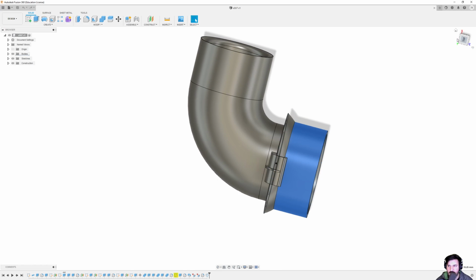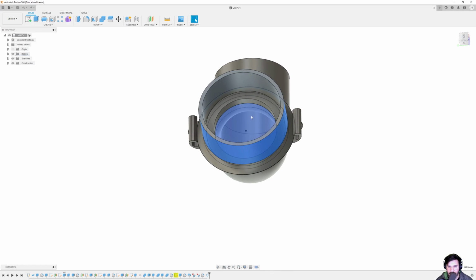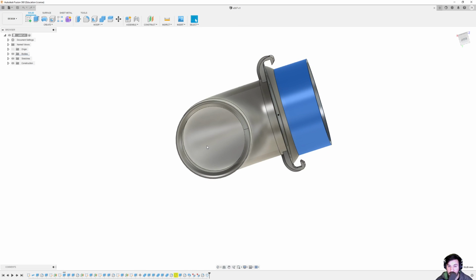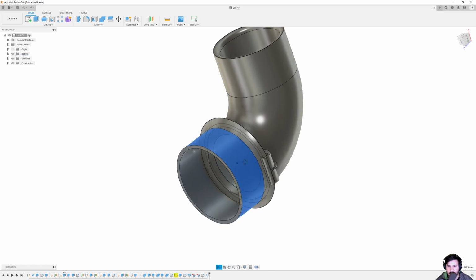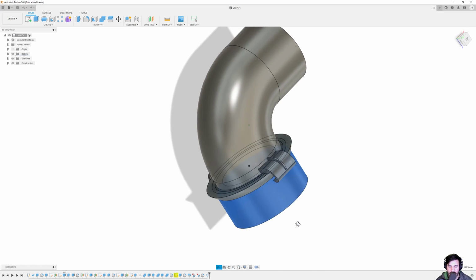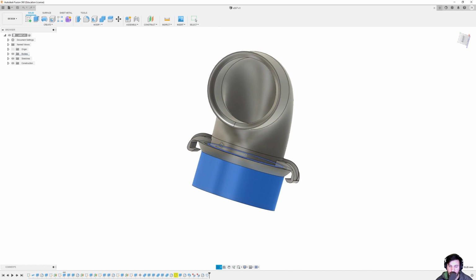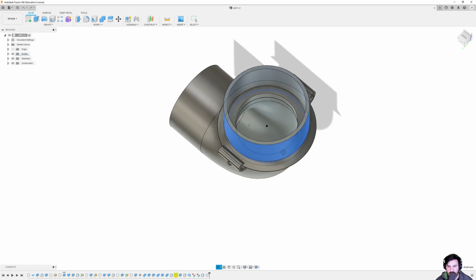So we ended up printing it like this, which required supports underneath here, underneath here, underneath here, and some supports to support this area right here, which would be inside of this cavity. But all the way down this circular chamber was empty, because this curve it could do with some minimal supports underneath. This curve it didn't need any supports for. And of course, this builds straight up, so it didn't need anything. So that was great. And instead of using old saturated PLA, we ended up using ABS, which is less brittle, obviously because it's not saturated with liquid, but in general, it's a little bit less brittle, a little bit tougher.